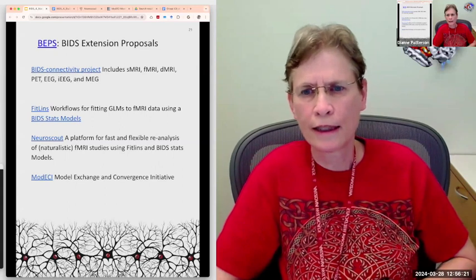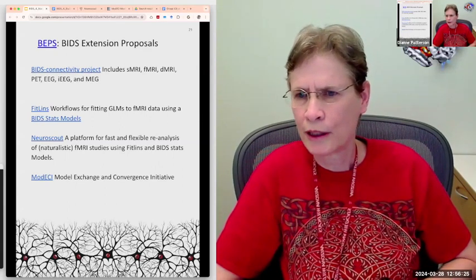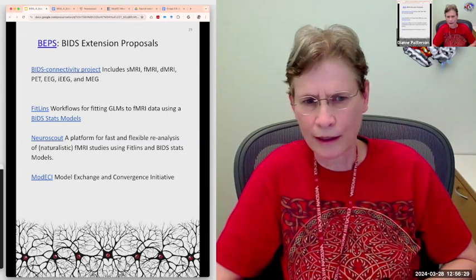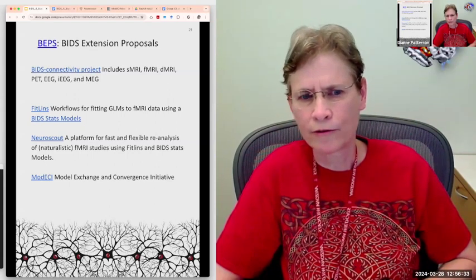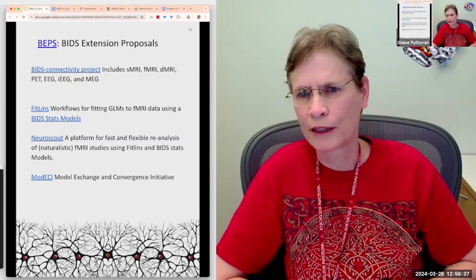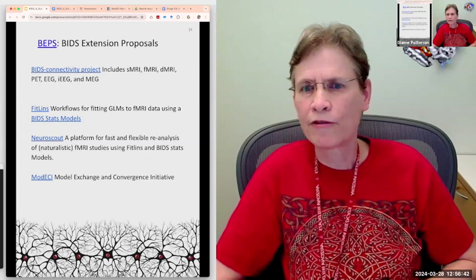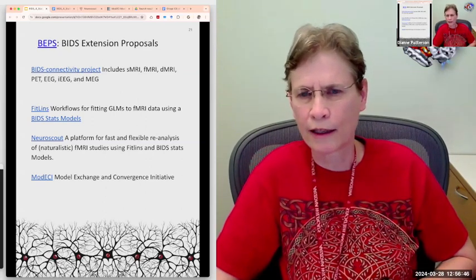I should say that despite there being only a few MRI manufacturers, something as simple as a T1 image from one scanner will have different features than from another scanner. And when you run the quality control metrics, you may get vastly different absolute values from one scanner than another.